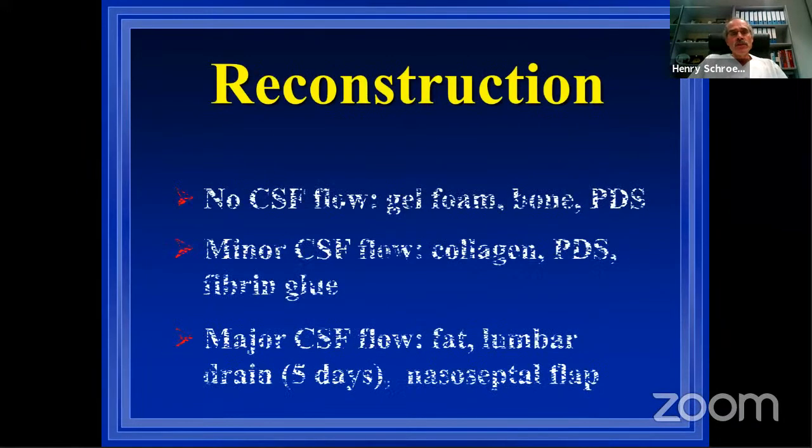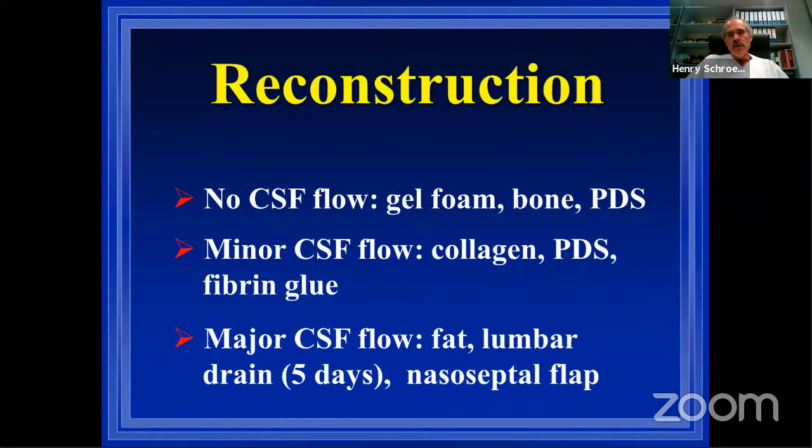So I just want to give you our techniques for skull-base reconstruction. I don't want to review the literature; you can do that on your own. I just want to give you some examples of how you can deal with CSF leakage.